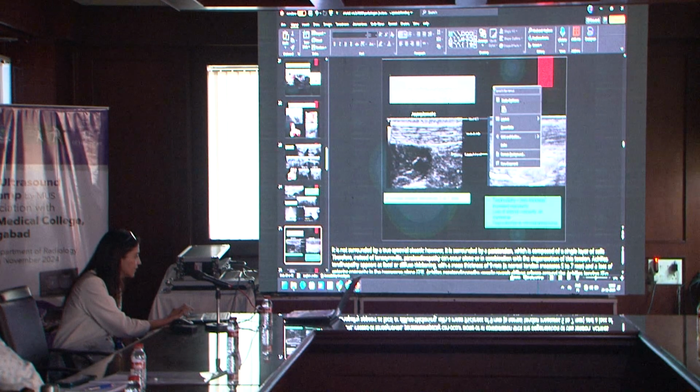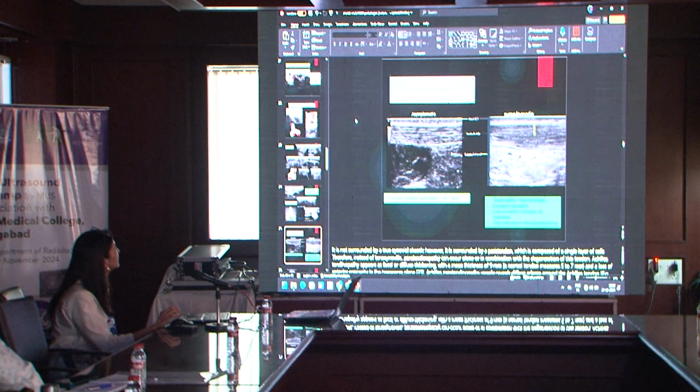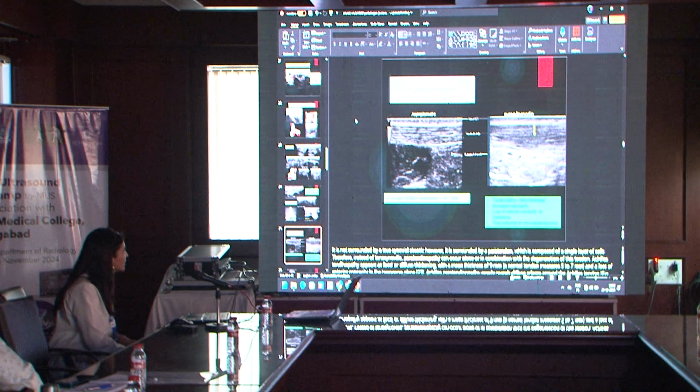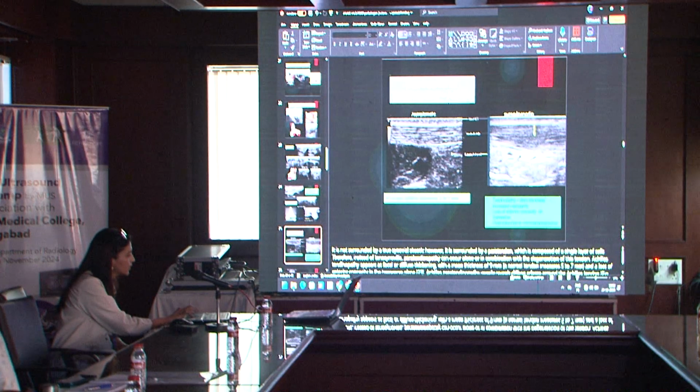Posteriorly we have the tendoachilles, and this is a case of tendinopathy. So this is non-insertional tendinopathy. This is somewhere a little further up, and this is the asymptomatic side. We see the nice layers: the skin, subcutaneous tissue, the tendon which is nice, echogenic, fibrillar. And on the symptomatic side, the skin and subcutaneous tissue are thickened, the tendon is thickened, and also the fat has become more echogenic.